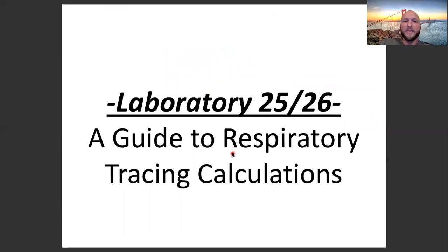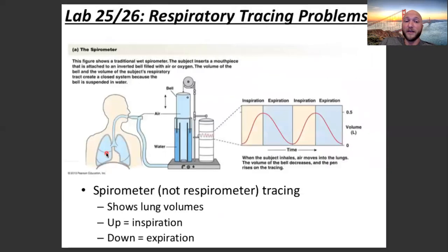All right, next up is the respiratory tracing calculations. So in lab, in class, we actually have one of these. So this is our spirometer.